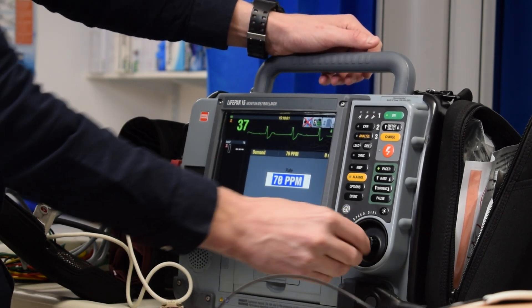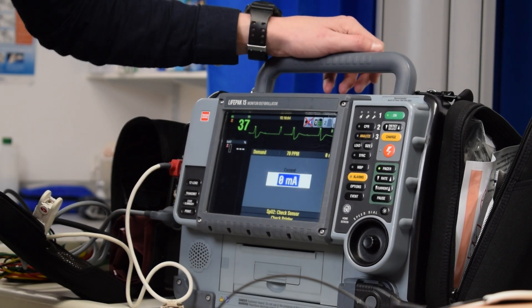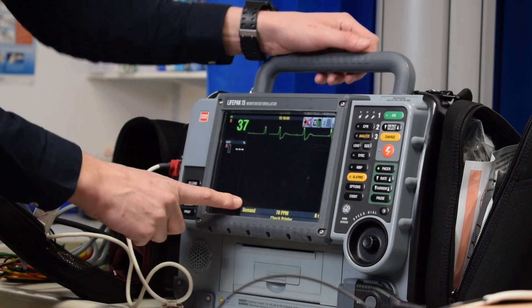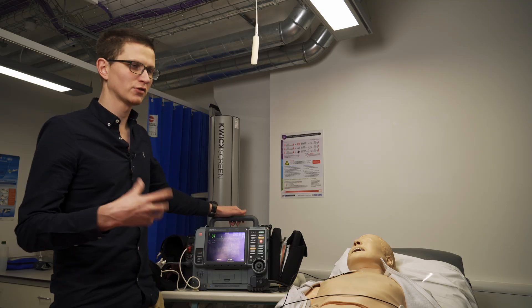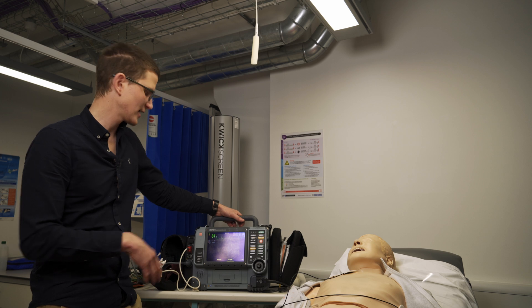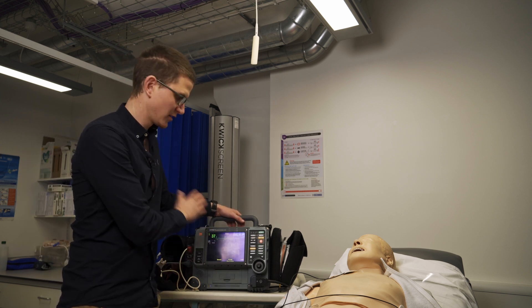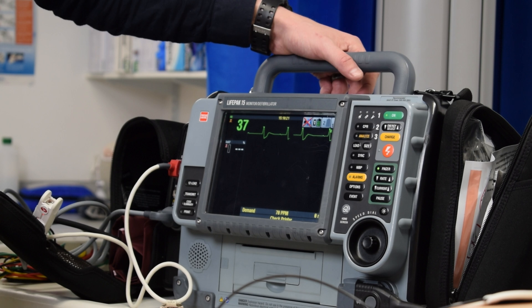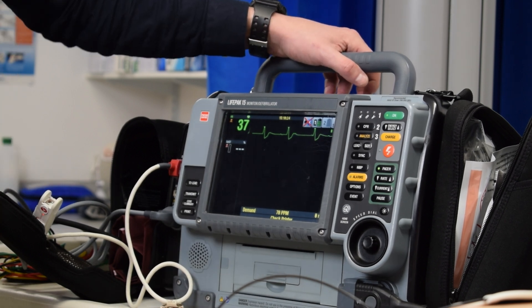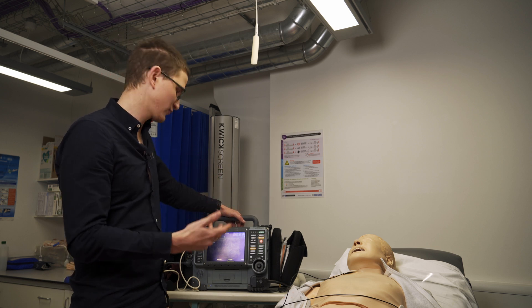Once we turn on the pacing module, it's going to ask us for rate and milliamps. We'll go up to 70 for rate. For milliamps, we're going to start with zero. You'll also see at the bottom it says demand. You can change from demand to fixed. Demand means that if the patient's intrinsic heart rate goes above 70, the pacer will turn off. On fixed, it will pace at 70 no matter what's happening with the patient.